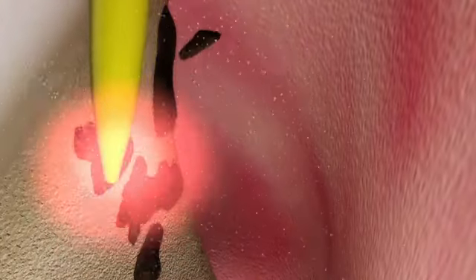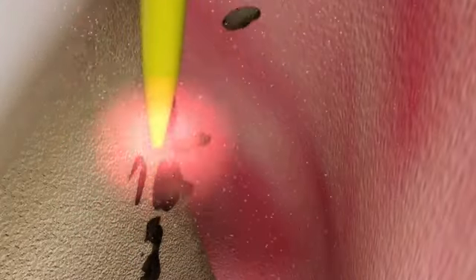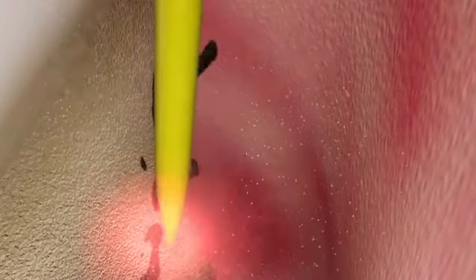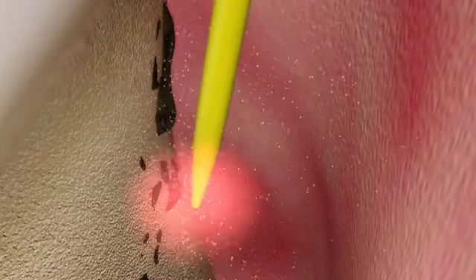With the laser firing, the tip is lowered along the root surface towards the bottom of the pocket until you feel a piece of calculus on the root surface. The Erbium YAG laser energy allows you to just tap it off. Not only does this step remove calculus, it also decontaminates the root surface and removes the endotoxins that will otherwise interfere with proper healing.